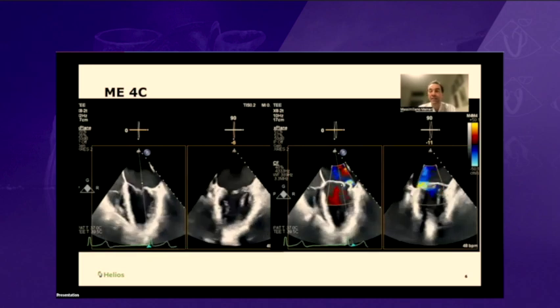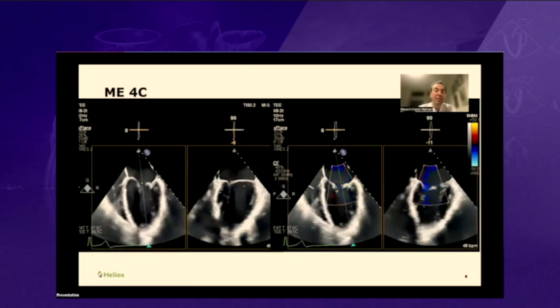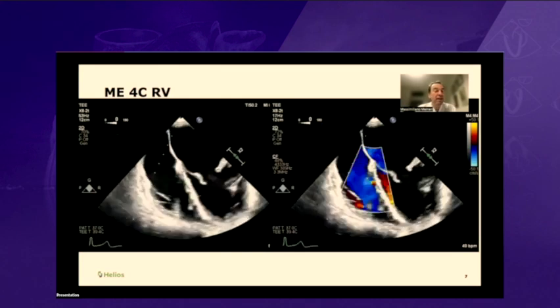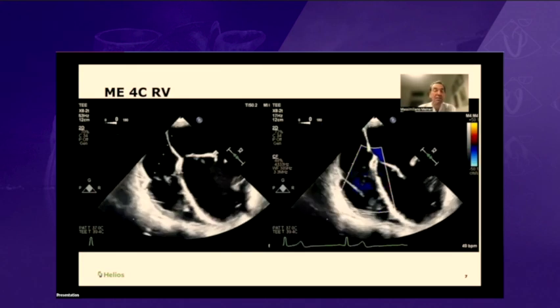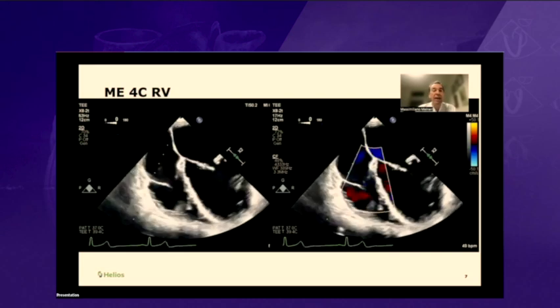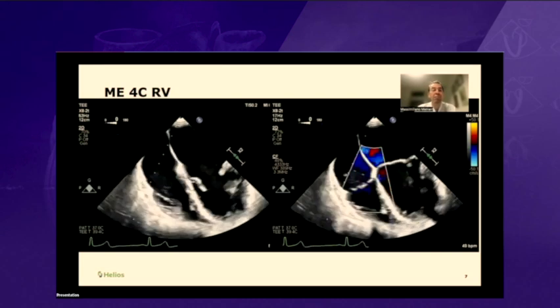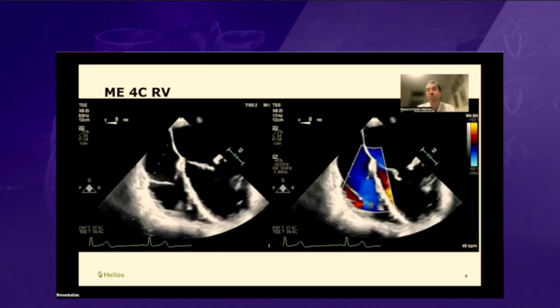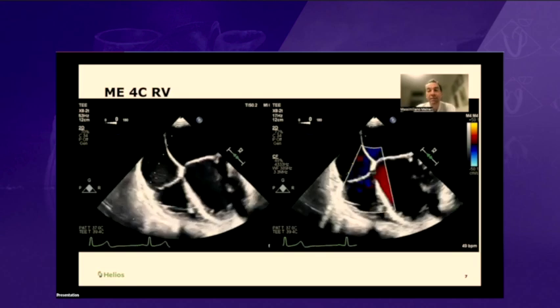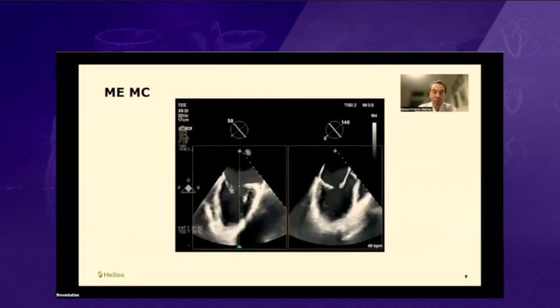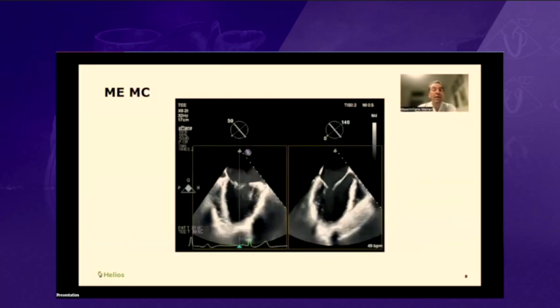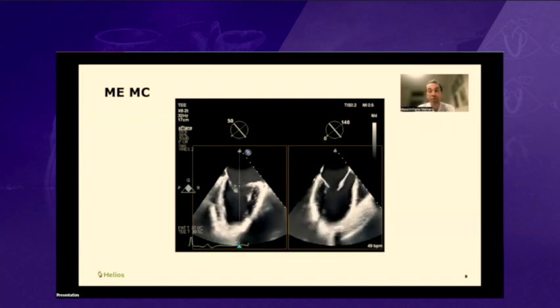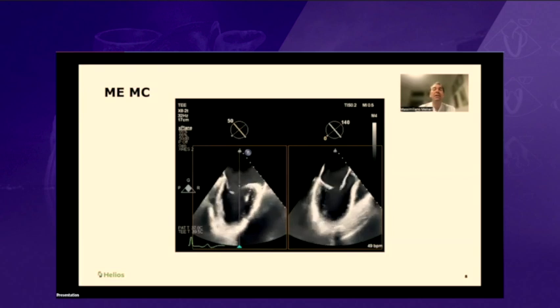That's a complex jet in the X-plane view. We look at the right ventricle — it is normal size, normal annulus, no tricuspid valve regurgitation whatsoever. So there is absolutely no indication to do anything to the tricuspid valve. Now we go to the mitral commissural view, which is the golden view for assessment of mitral regurgitation.